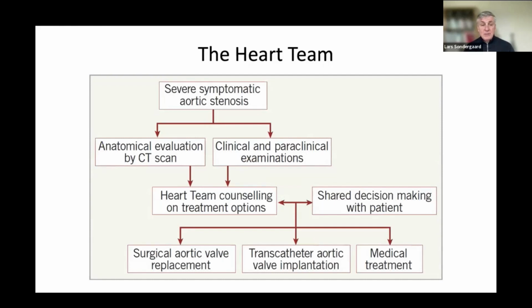And I would also say, since we started to do CT scan routinely on all patients referred with aortic stenosis, I do not personally recall when I was last called to the OR because they had opened the sternum and found a porcelain aorta and couldn't clamp the aorta. That's completely gone now. We don't see that anymore. So I think CT scan early in the workup is really important to optimize the outcome for the patient and also make the right decision for how to do it.